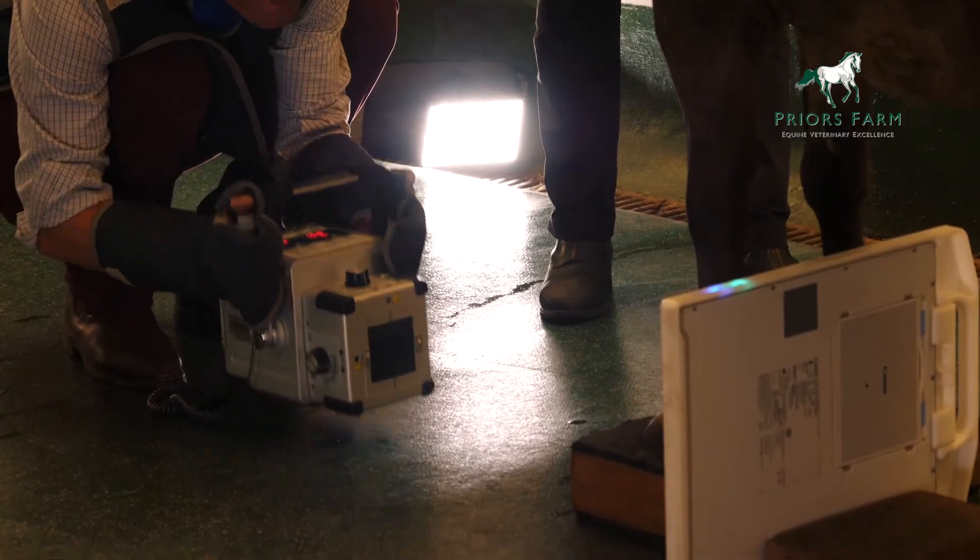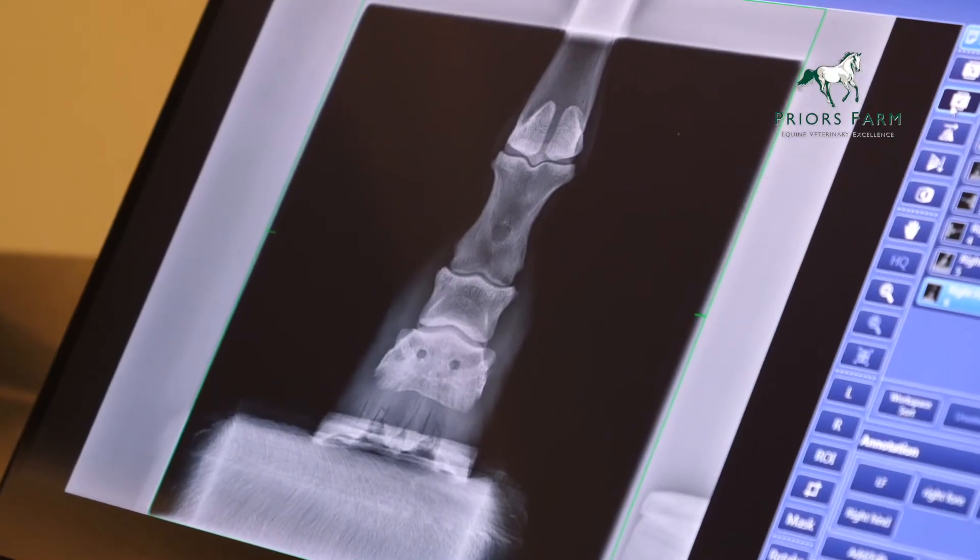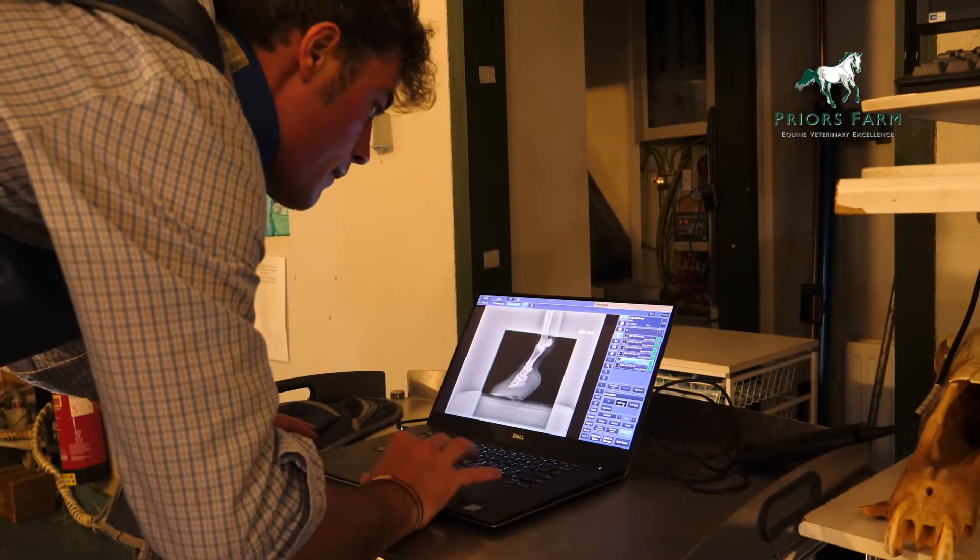You must make sure that the beam is perpendicular to the area of interest. That enables us to make sure that there is no distortion of the image. We often take several views of the same part of the horse to make sure we have an idea of a potential problem that might be hidden from one view. It's not quite the same as doing a 3D image, but it's as good as we can get.